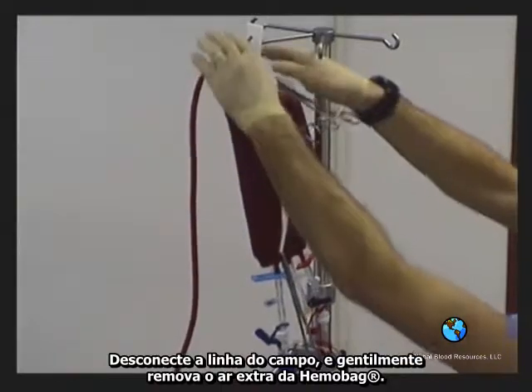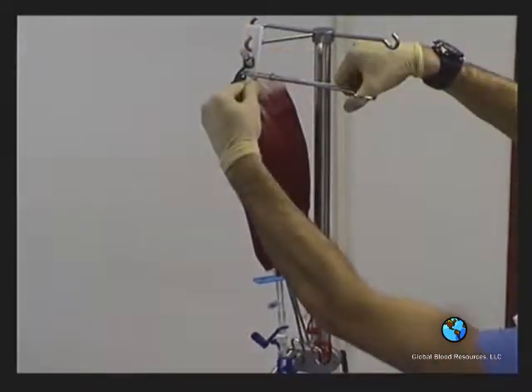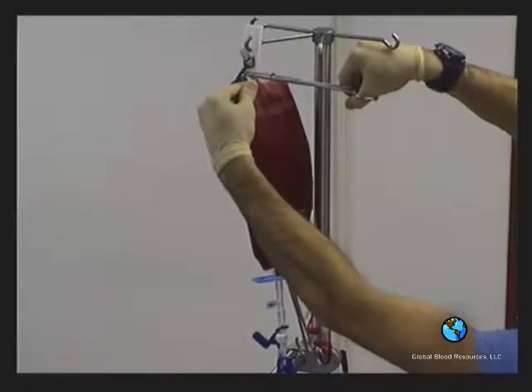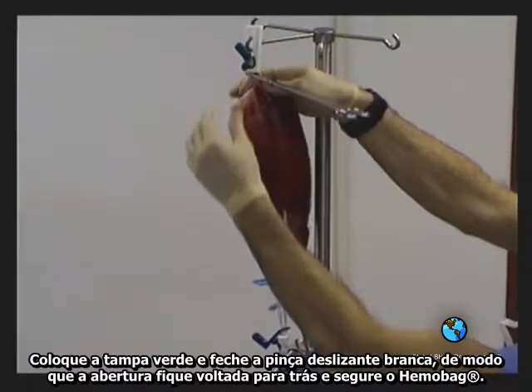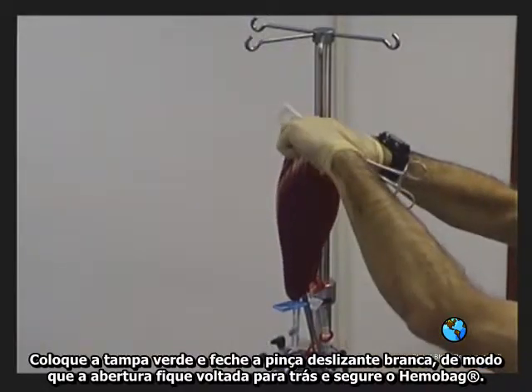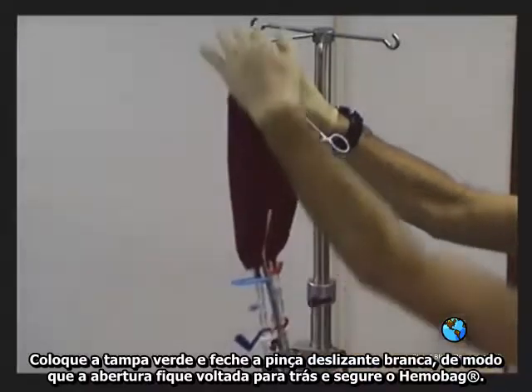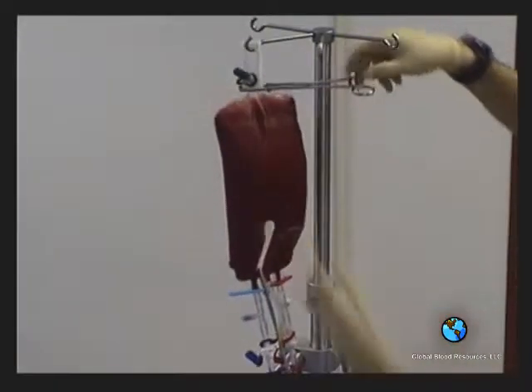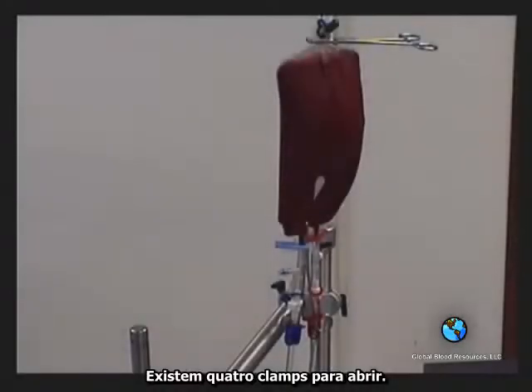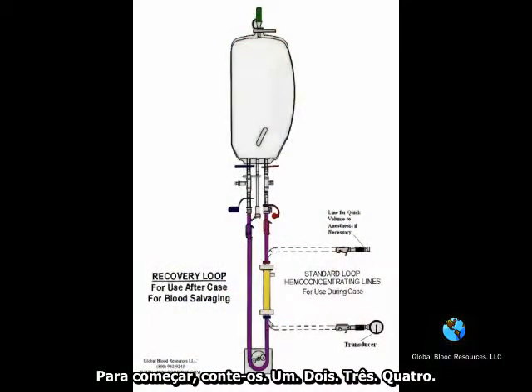Disconnect the line from the field and gently burp the hemobag of extra air. Place the green cap on and close the white master slide clamp so that the hole faces back and rehang the hemobag. It's okay to leave the tubing clamp on the top of the hemobag. There are 4 closed clamps to open up. To get this started, count them out.